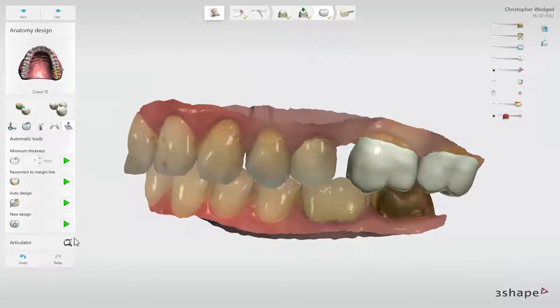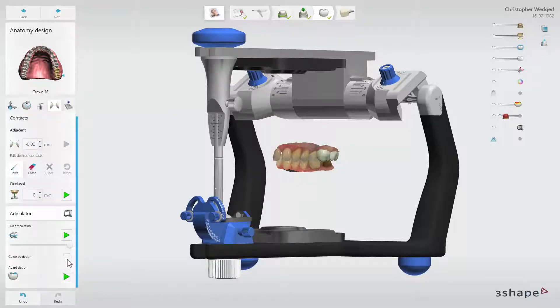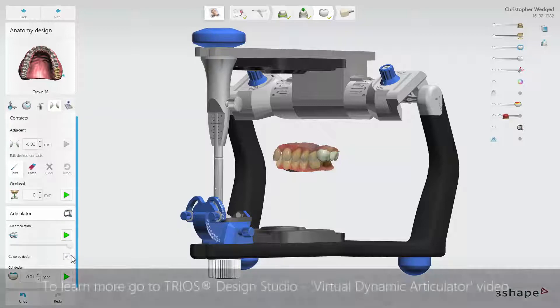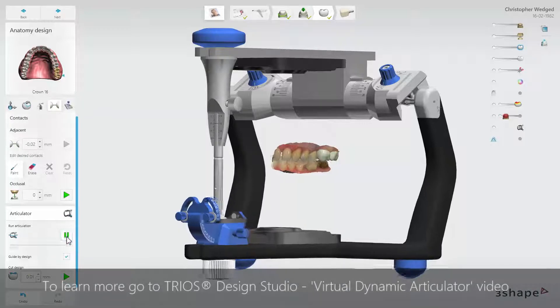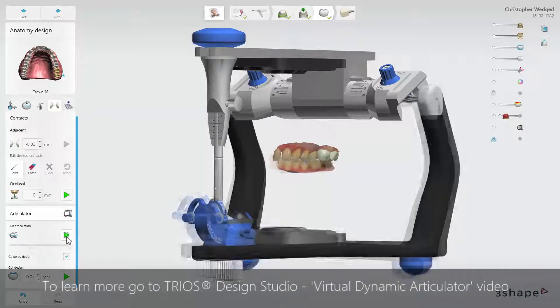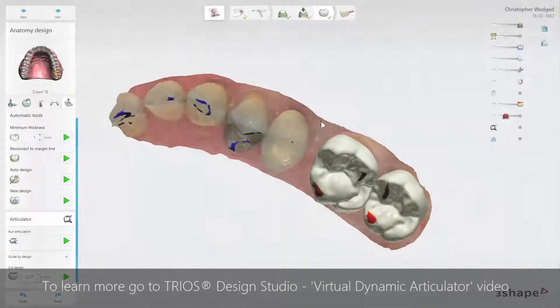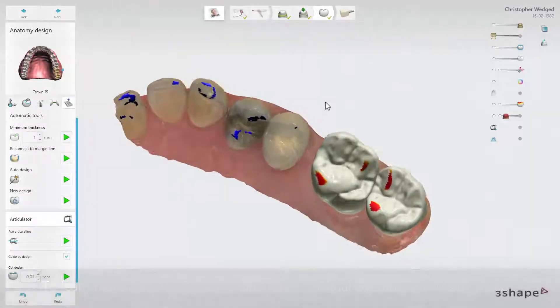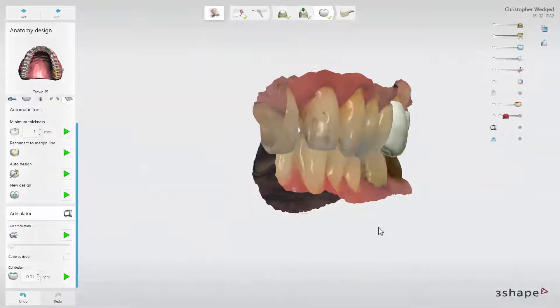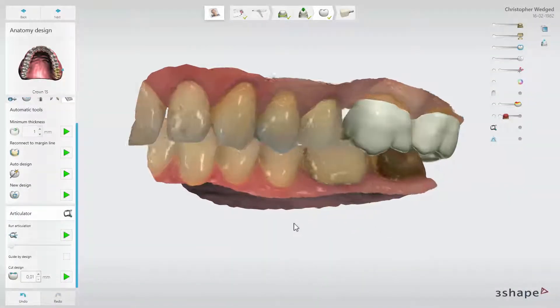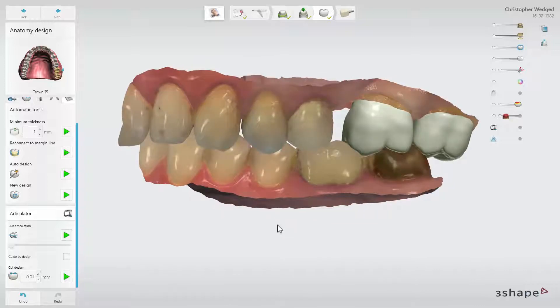When the designs are ready, you can check the dynamic occlusion using the Virtual Dynamic Articulator. You can also enable Guide by Design to have movements guided by design if necessary. Then click on the Play button to see the occlusal contacts during jaw movements. Having the designs ready, move to the next step, which is the CAM module, and start production.